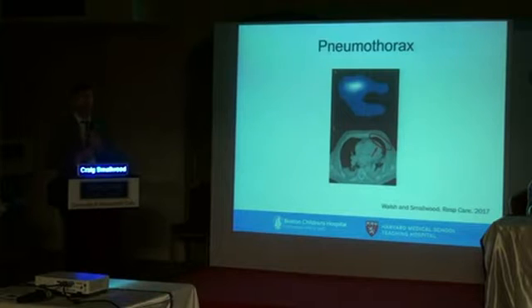One of the first, and I think most obvious, is detection of pneumothoraces. So this is from a review paper that my colleague and I wrote, and this is some real data. You'll see a lot of the earlier EIT publications tend to have two images, one CT or MRI right beside the EIT image, and that's really to convince us, because I think as clinicians and researchers it's prudent for us to be skeptical of any new technology until it's proven to us that it's worthwhile.